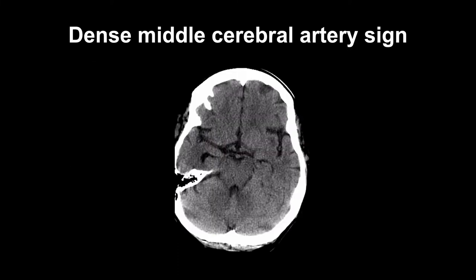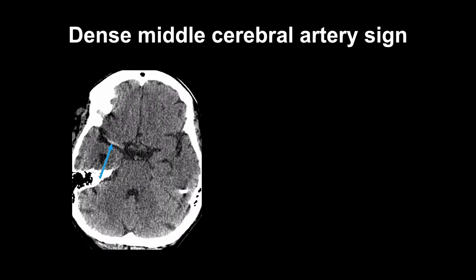On this scan of a patient with an acute left-sided hemiparesis, the right middle cerebral artery appeared to have slightly higher attenuation than the left. This image is a standard 5 mm thick reconstruction of the patient's CT scan data.